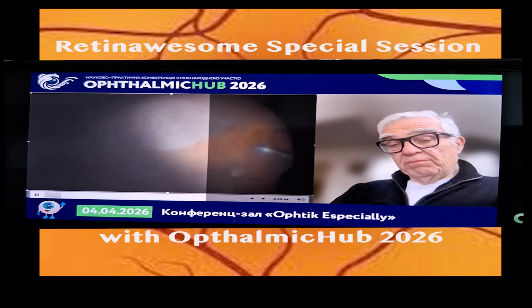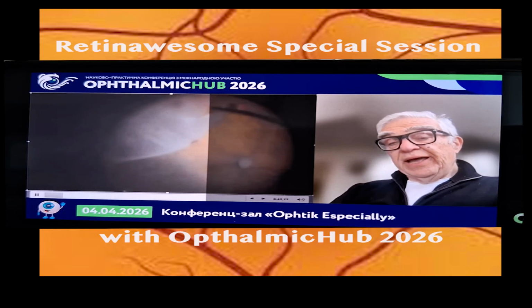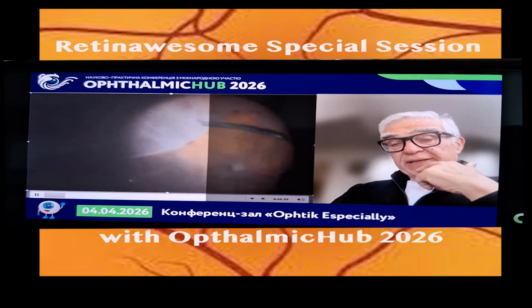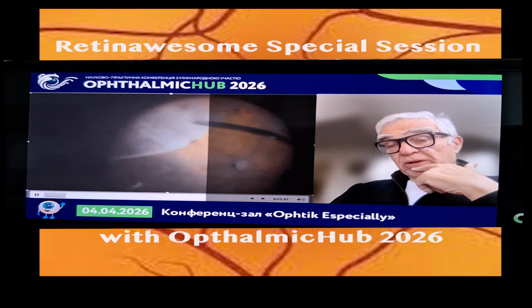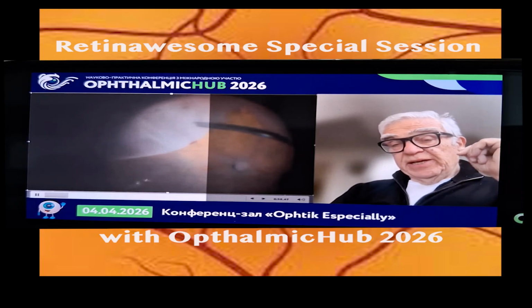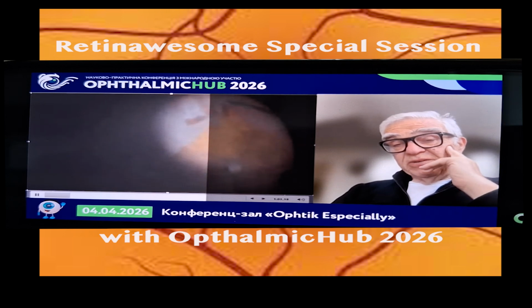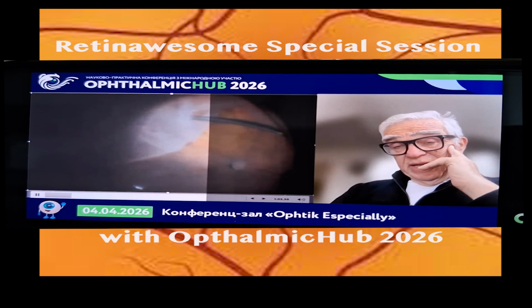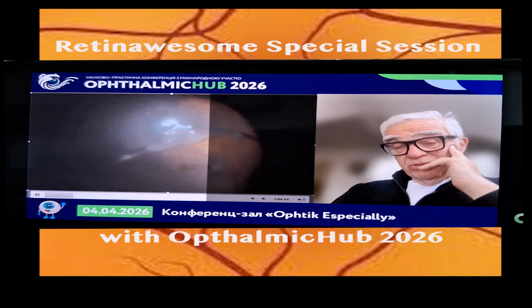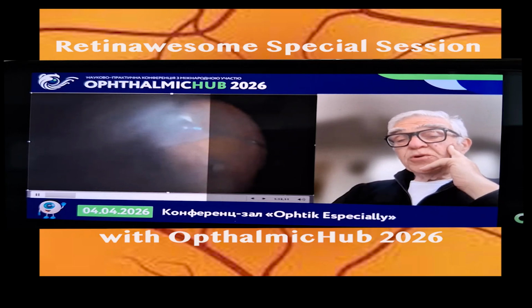So little by little, by cleaning the vitreous, we saw that there was a tear in the area posteriorly, that it looked small enough, but it's a tear, that's why it was producing a retinal detachment. And we decided to search the area and remove the vitreous behind this area. And we got a big surprise. A nucleus much bigger than the tear was behind the retina.